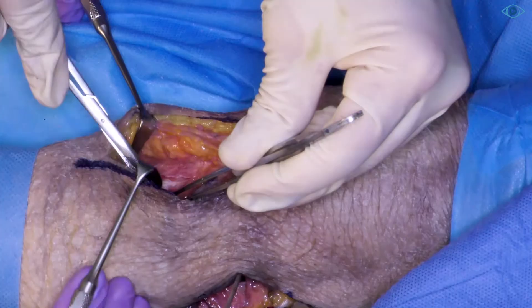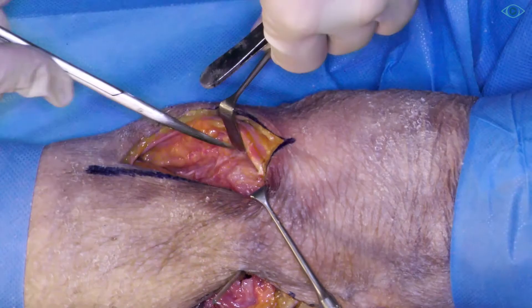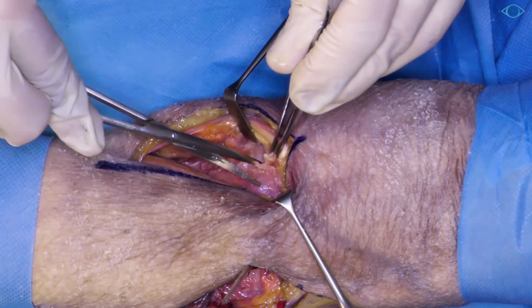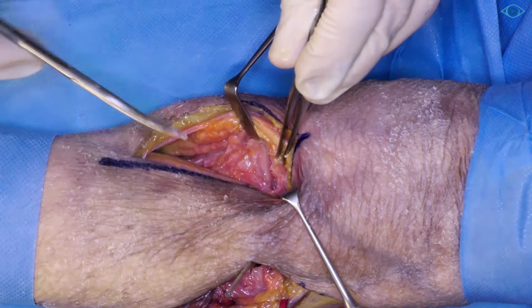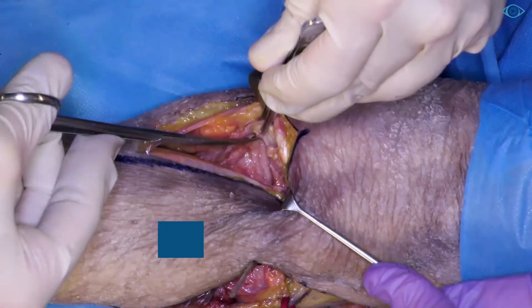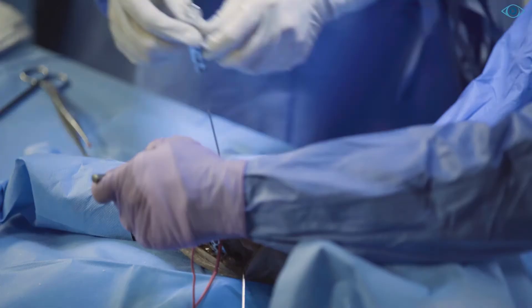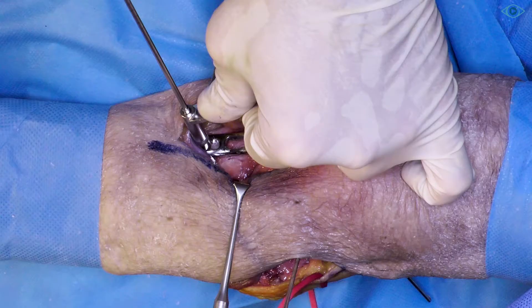And now the fracture appears. This is the fracture, and of course this has to be properly reduced and fitted here. The posteromedial capsule is extremely thick at the back, and if you want to see the joint, you can also detach the capsule from the tibial plateau. We enter the capsule here in the back — cutting the capsule and the meniscotibial ligament is not dramatic. And now we can look into the joint onto the joint surface. With my tweezers, I'm holding the semimembranosus. Here you have to be very careful — you cannot cut more, otherwise the knee becomes ligamentarily unstable. You can see the fracture here; the fragment is positioned quite well. Finally, we can apply the plate posteromedially to hold the main medial fragment.